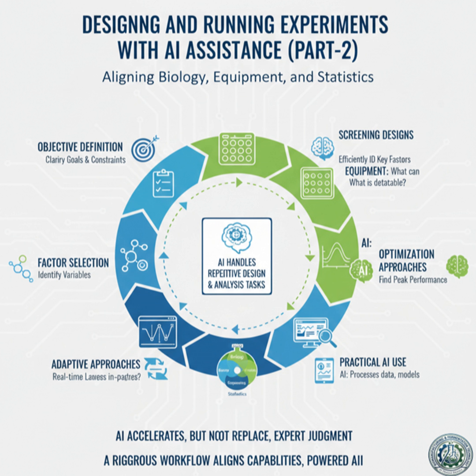Why does media get its own special category of math? Because media is a recipe, and recipes are zero-sum games. This is something people often forget. If you have a 1-liter formulation and you decide to increase the glucose solution by 10%, you have to remove 10% of something else. Usually water. Right, usually water, to keep the volume at 1 liter. So the factors aren't independent. I can't just change one without affecting another.